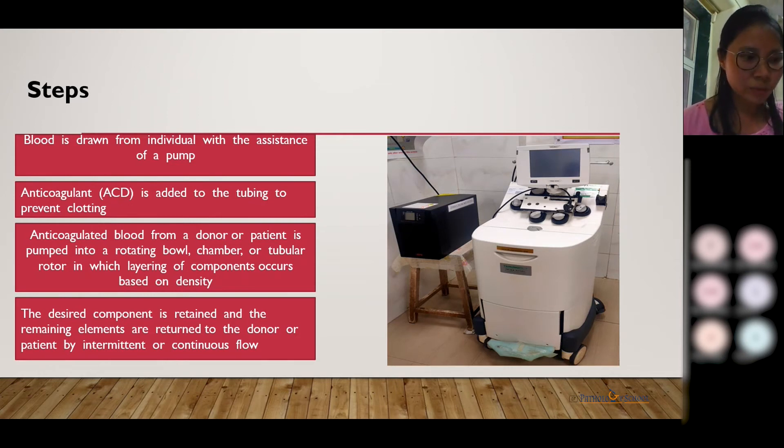This is the apheresis machine that we have in our hospital. In our setting, we have well-trained staff to handle the instrument, and a trained doctor is always available to monitor throughout the whole procedure.